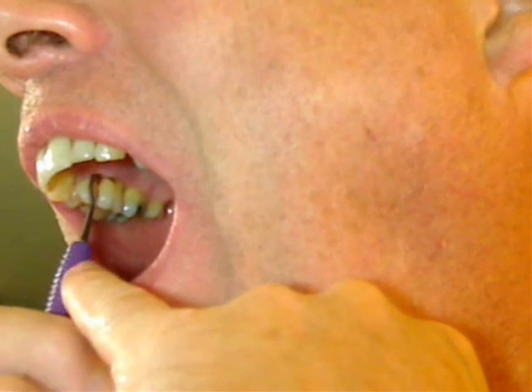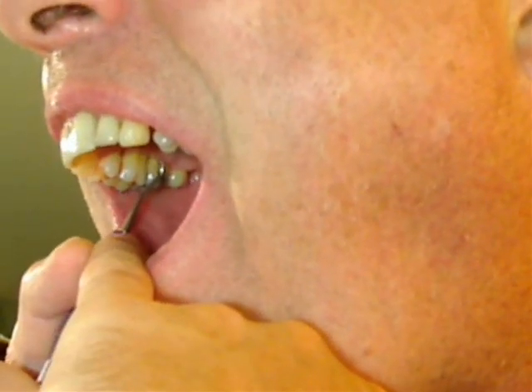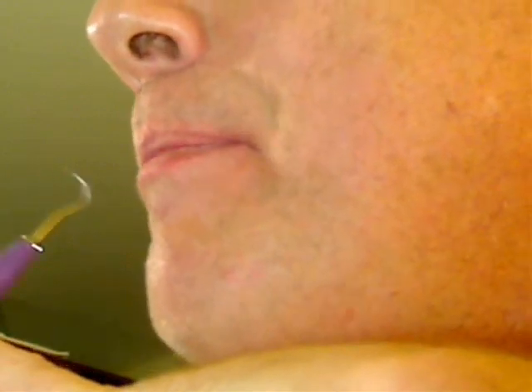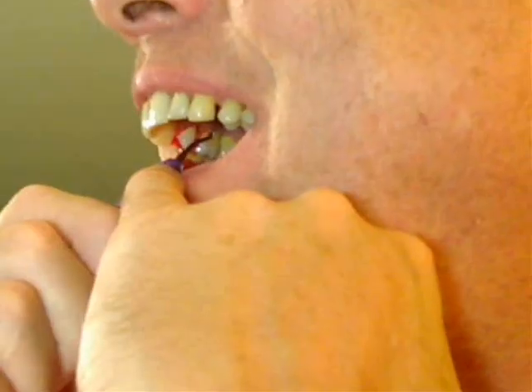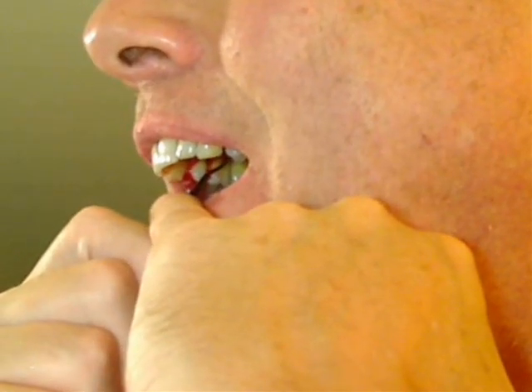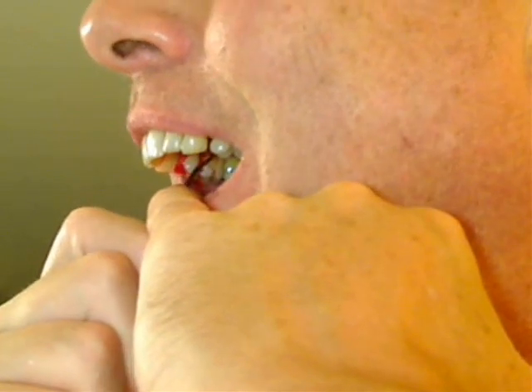Let's go in reverse — I find the reverse very awkward. Let's see if I can come from the back around the corner. This part is pretty important too. I'm going to sweep from the back to the forward, go along the bone, look for these things, and just get them to come loose. It looks like I got some of it. Let's go for the deeper stuff now.